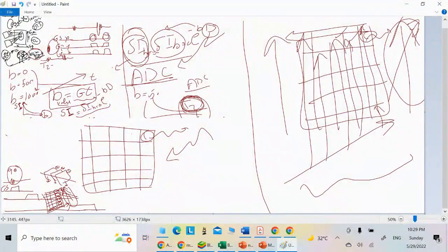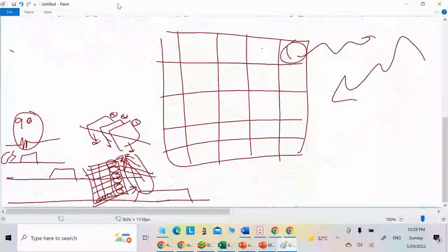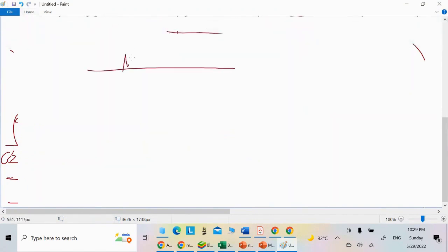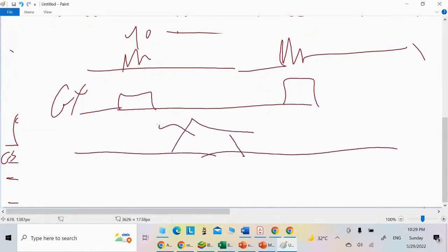Yes, then you start doing what exactly? Now here is the 90-degree pulse, and here is the 180-degree pulse, for instance, in this context. With the 90 degrees you have slice selection, and with the 180 you also need a slice selection gradient to differentiate between the sections. Here, you will apply the phase encoding gradient. Now, perform the frequency encoding gradient recording.